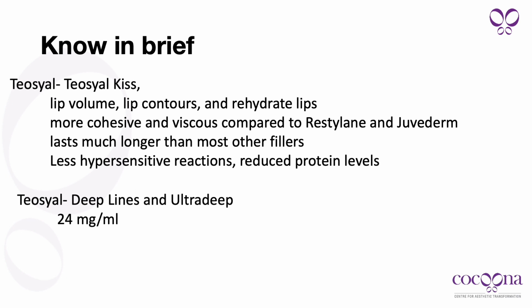And Teosyal Deep Line and Ultra Deep Line was my favorite for a long time. It had 24 milligram per ml. It had higher water absorption and was good for volume, so it lasted very long. I've seen results last almost a year and a half to 2 years.